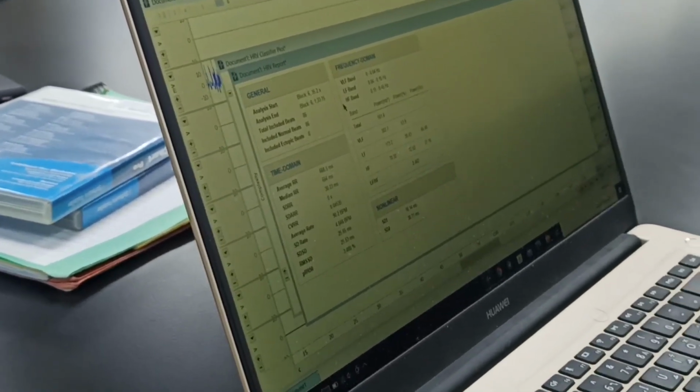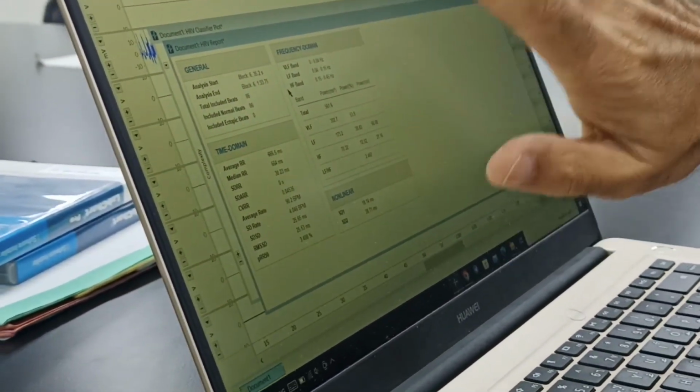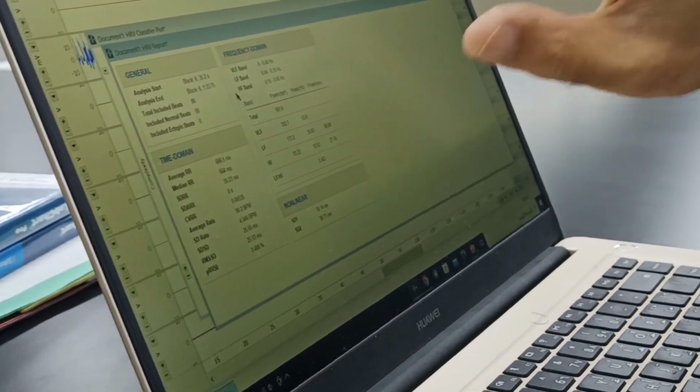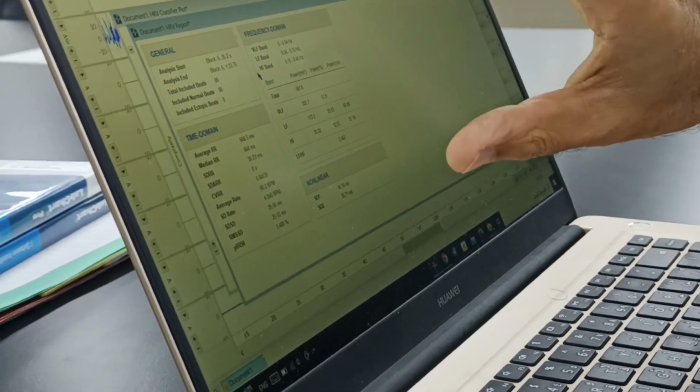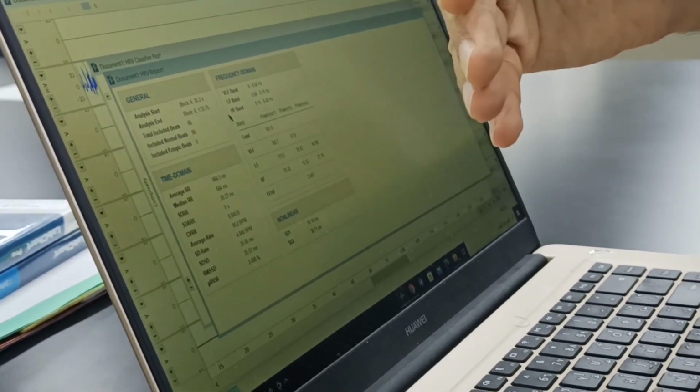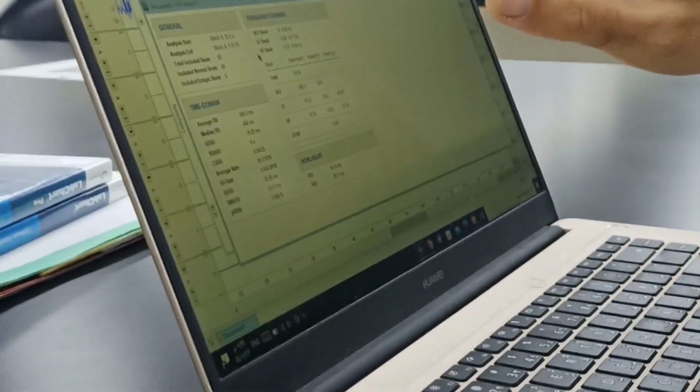SDRR. SD, you understand, standard deviation. Standard deviation is the bell curve deviation from the median. Some of them are plus, some of them are minus. So the standard deviation of RR interval on an average in this 1 minute segment is 30.23 milliseconds. This is a very important parameter that is usually stated in your articles, whether it was the SDRR or SDNN.